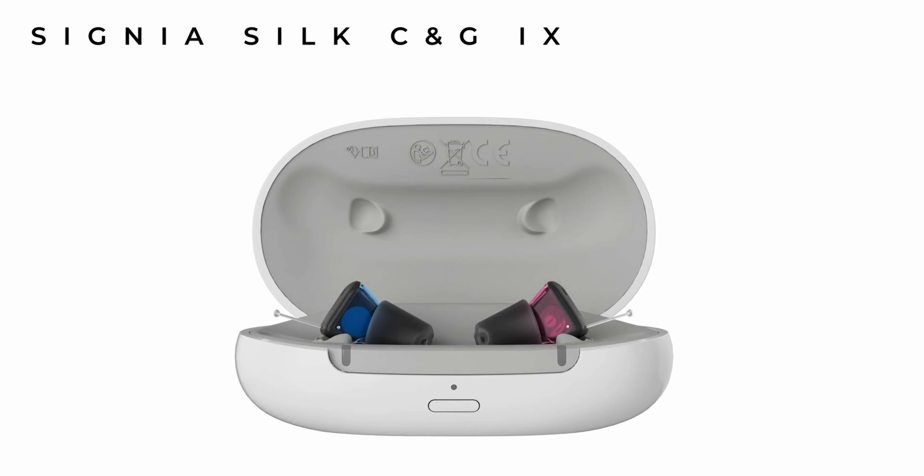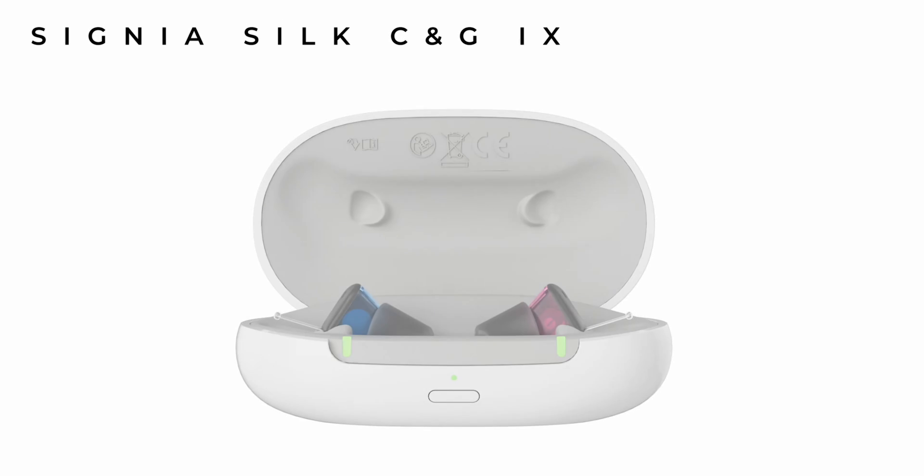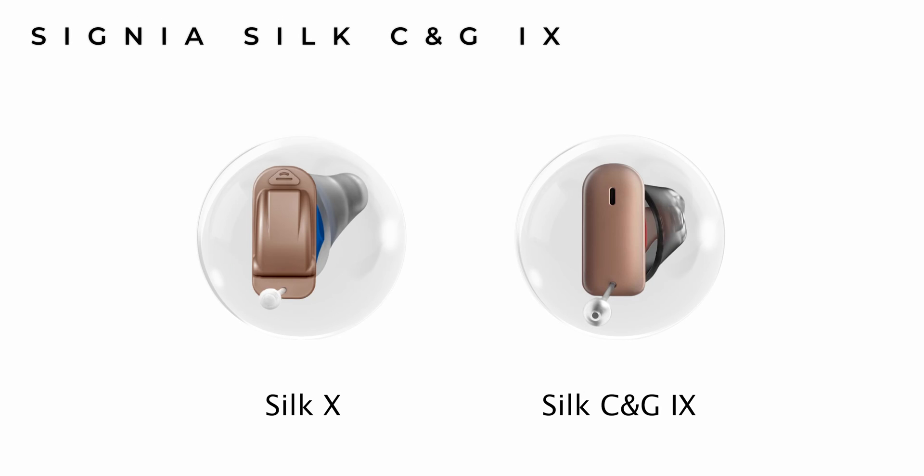This new family of hearing aids doesn't look any different in shape and size to the previous model. And I'm honestly amazed that they've been able to make this new rechargeable version with exactly the same physical specifications of the battery version.